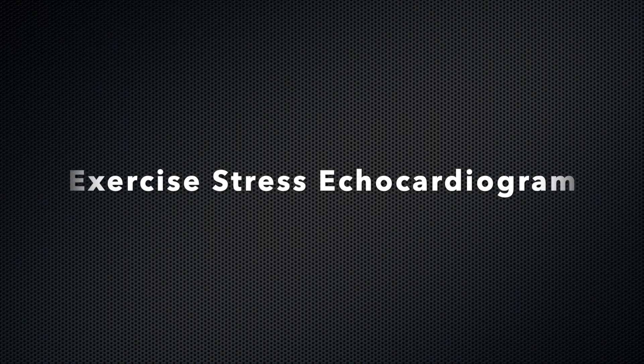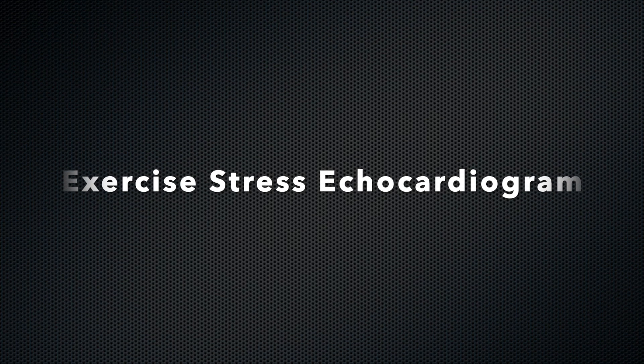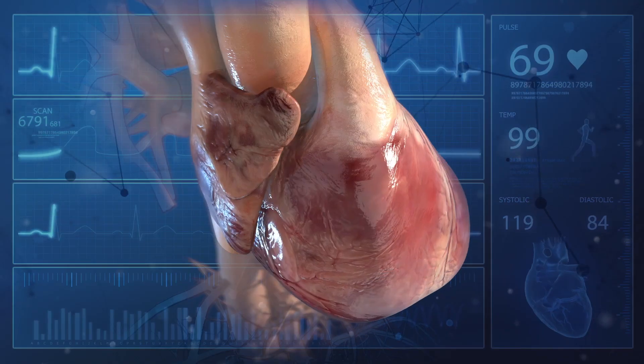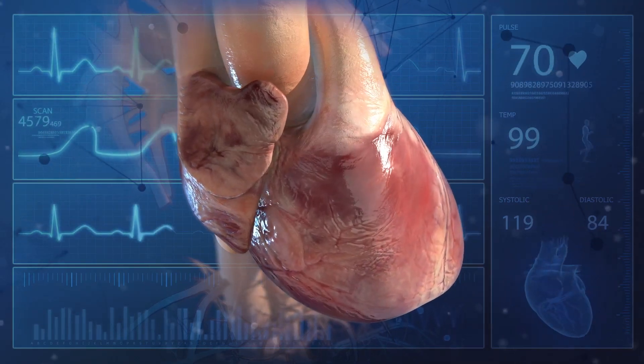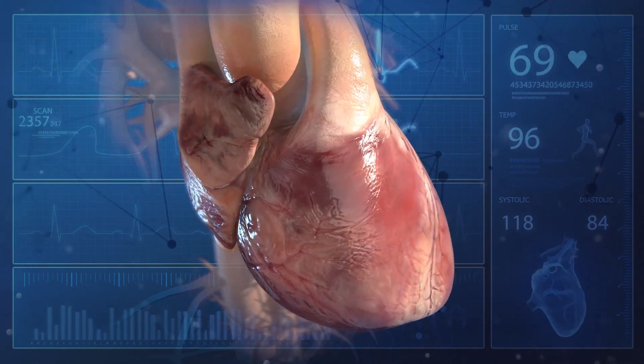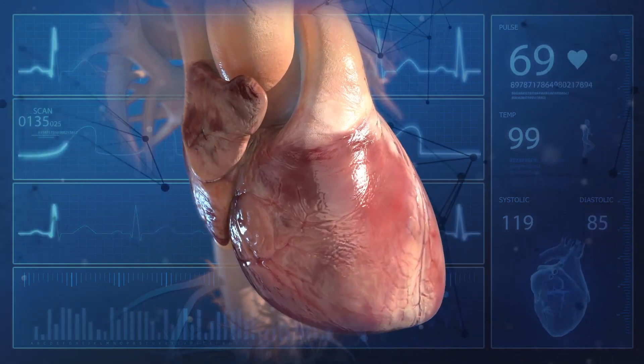Hello. Today your doctor has asked you to complete a treadmill stress test. In this video, we will guide you through the process of the testing. This test will provide your doctor with valuable information about your exercise performance, symptoms, and some heart functions with exercise.